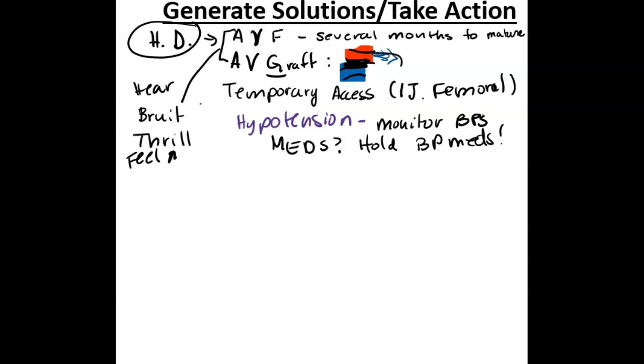And I wanted to draw an actual kind of synthetic loop fistula there. So anyways, as we're going on, so constant assessments on the dialysis. We want to make sure that the patient is stable to go to dialysis, including their weight and their vital signs, listening to their heart sounds, their lung sounds, and then repeating the process after it's done.